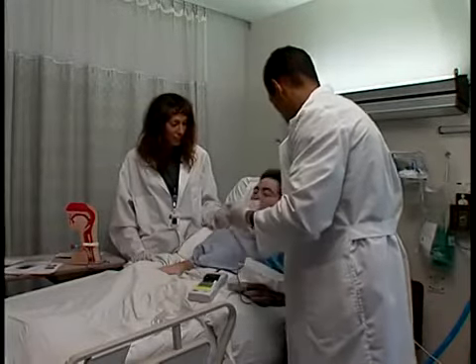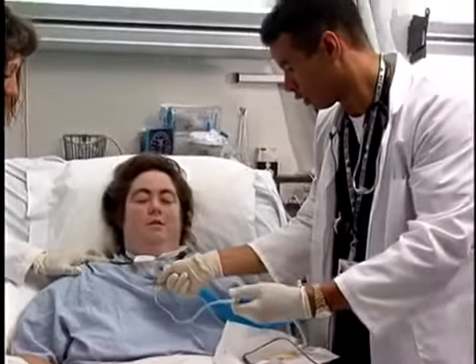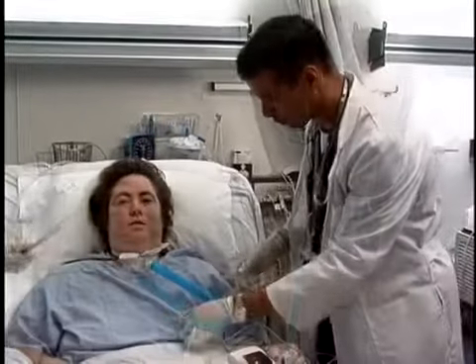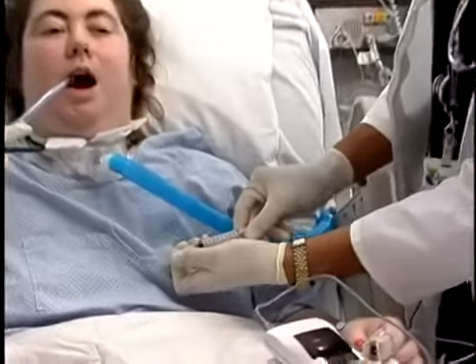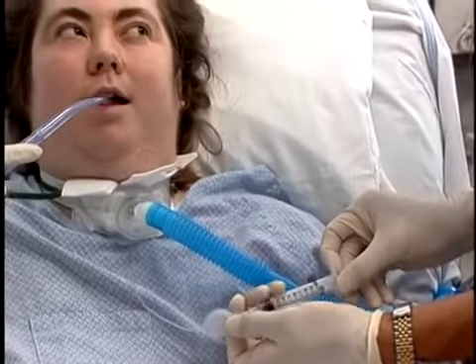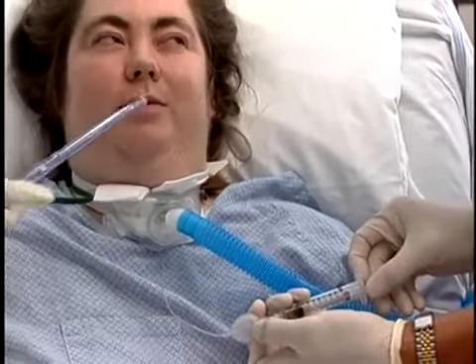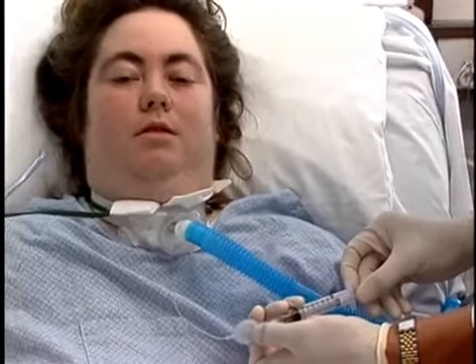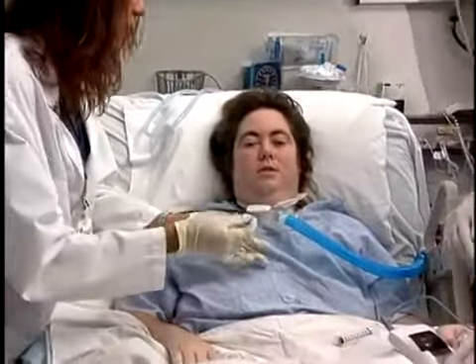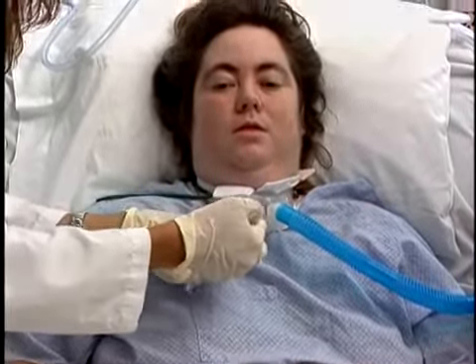If the patient has an inflated cuff tube, suctioning during cuff deflation is desirable to catch secretions that have been sitting on top of the cuff, which may penetrate to the lower airway. Deflate the cuff slowly, allowing the patient to acclimate to the sensation of airflow through the upper airway. It is imperative that the cuff be completely deflated prior to placement to maximize the amount of space existing between the tube and the tracheal walls for adequate exhalation. Attach warning labels provided with the PMV to the pilot balloon of the patient's cuffed tracheostomy tube at the patient's bedside and/or in the patient's chart.